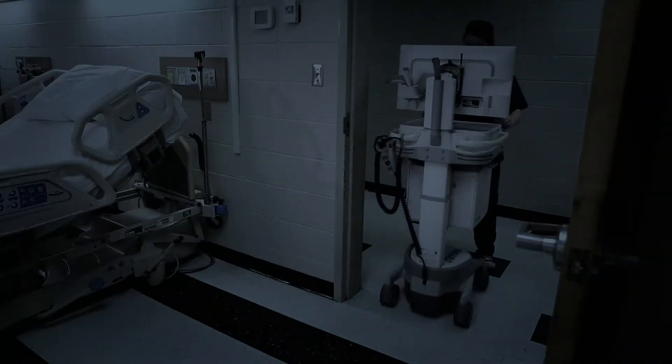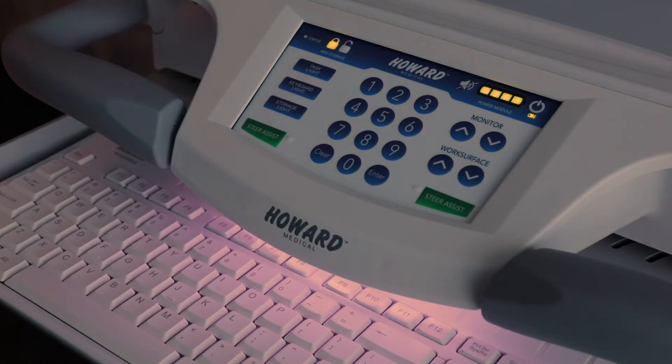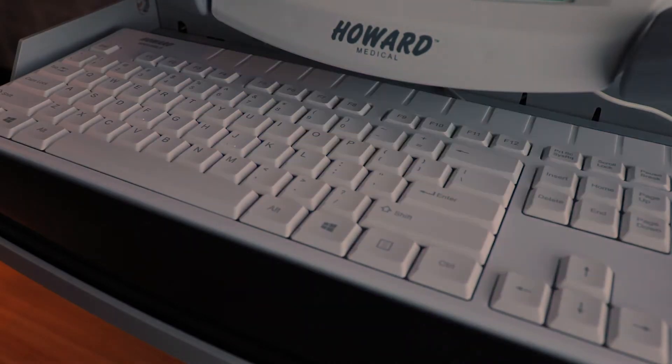When working in low light conditions, the cart is equipped with a keyboard light. Press the keyboard light button located on the left side of the keypad once to activate it. Pressing the button again will cycle the light through normal, dim, and off settings.